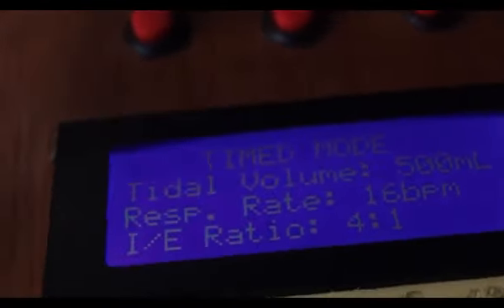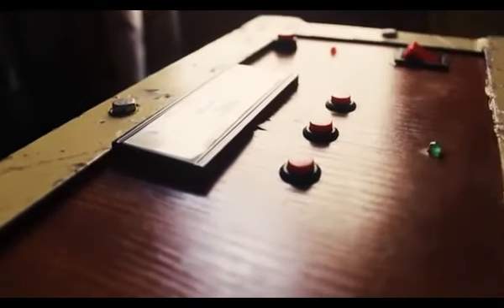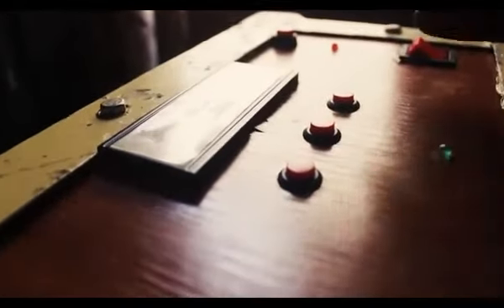On the system, we have an LCD display screen which shows the variables, that's the parameters, and also shows the mode the system is currently in. We also have 3 push buttons which control those variables. One push button increases the variable, another decreases it, and the last locks down the value, which we call the set button. We also have a buzzer that indicates when the system has switched from one mode to the other, and inside the system we have pressure sensors, which help to monitor when the patient is about to take in oxygen and then supply the oxygen to the patient.